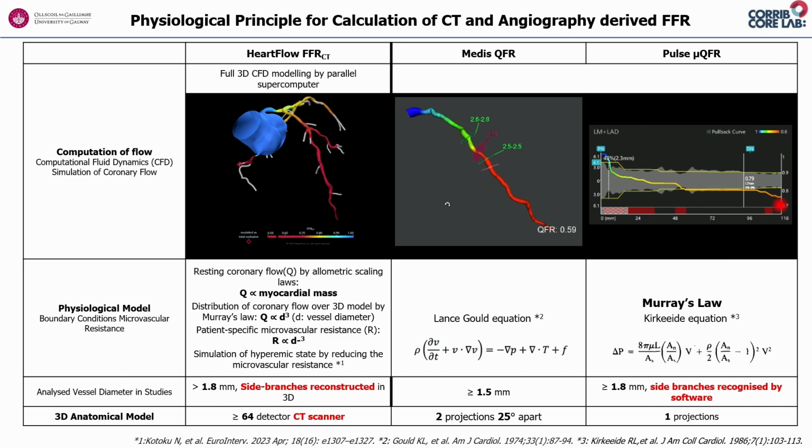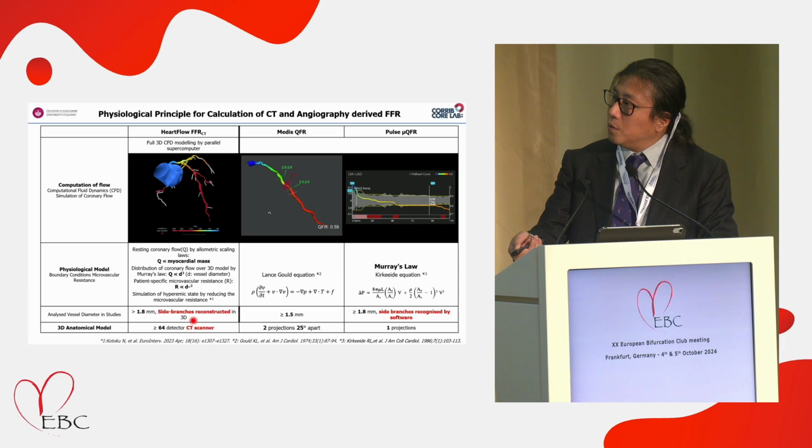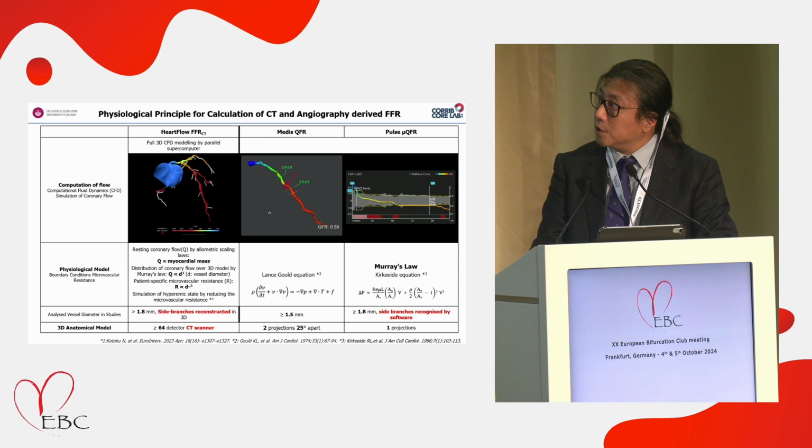So the HeartFlow software recognizes the side branches because all side branches are reconstructed in 3 dimensions. myoQFR also recognizes the side branches in this analysis. Medis does not really see or calculate the side branches in its analysis.